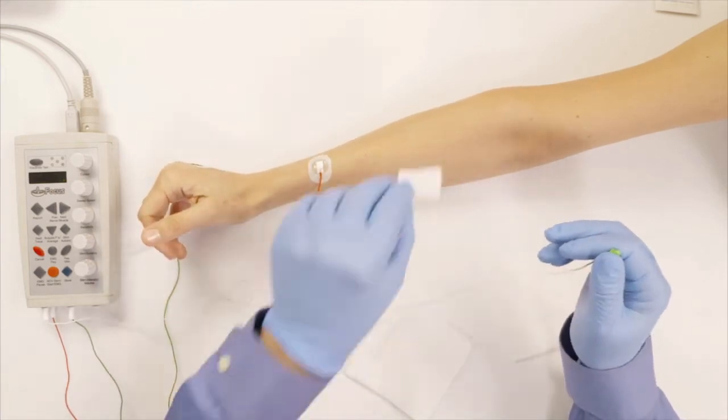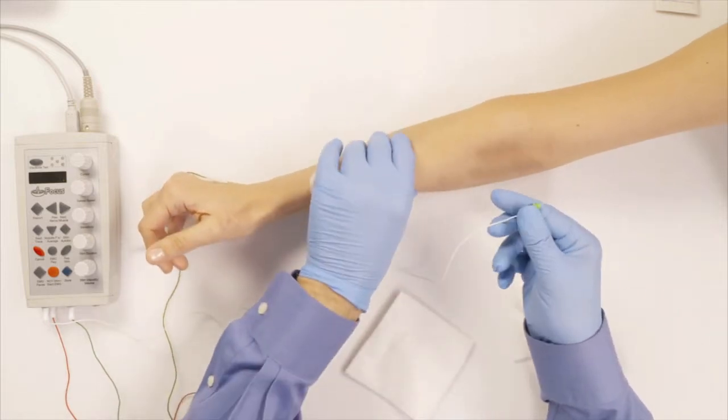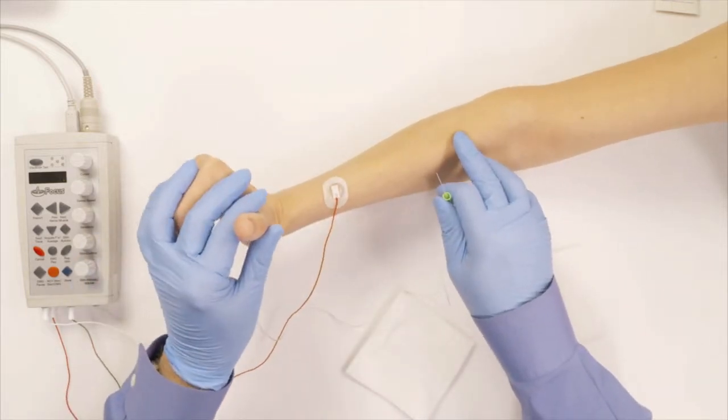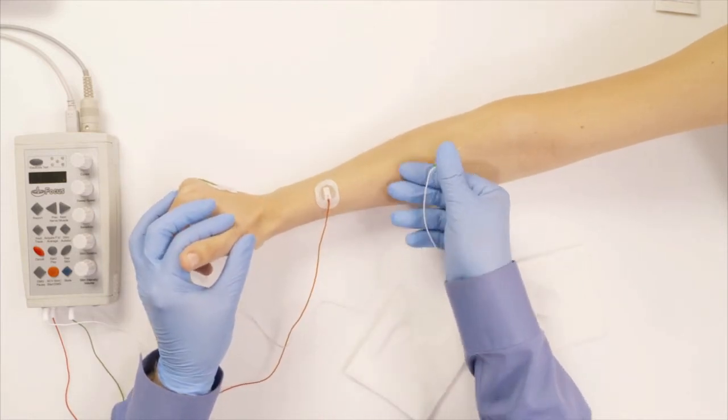So then I wipe the skin with alcohol, and again, raise your arm up a little bit, like so. Okay, now I can see exactly where the muscle is, and I go in.